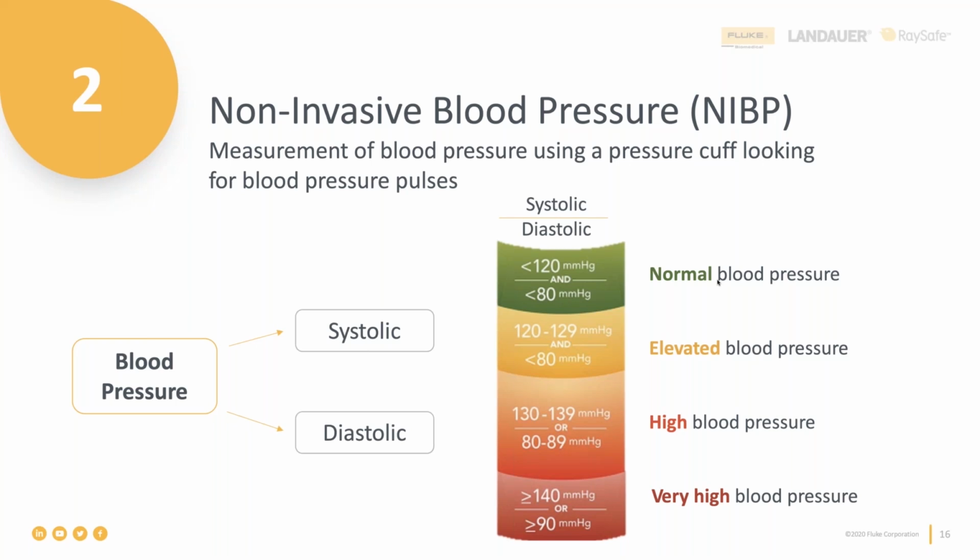The way an NIBP device works is it automatically inflates and deflates the cuff that is placed on the patient. That is being done continually, but it is very similar to the manual process of checking blood pressure non-invasively. NIBP machines in general have a few parameters that can be adjusted by the nurses or other hospital staff. The three main parameters are setting the initial inflation pressure, setting an interval for blood pressure monitoring, and last but not least, setting alarms.